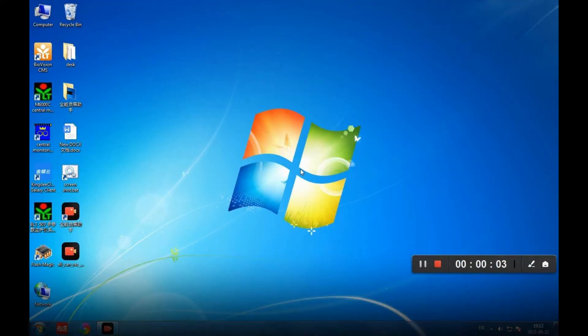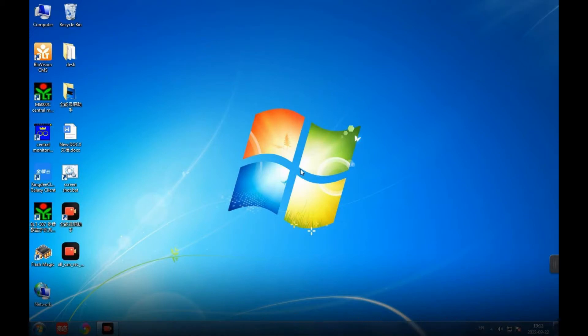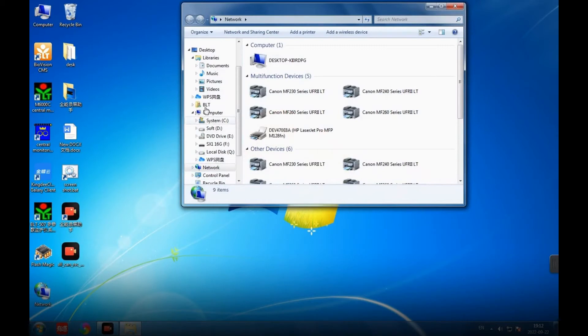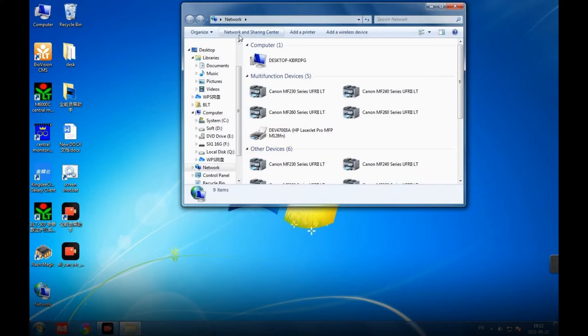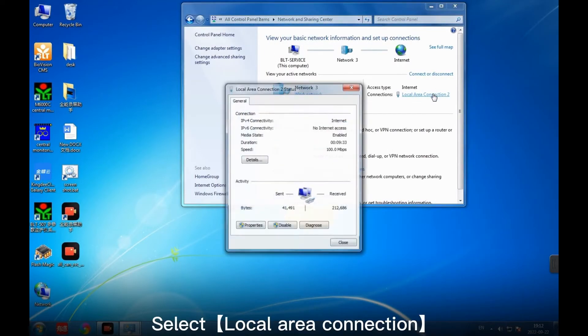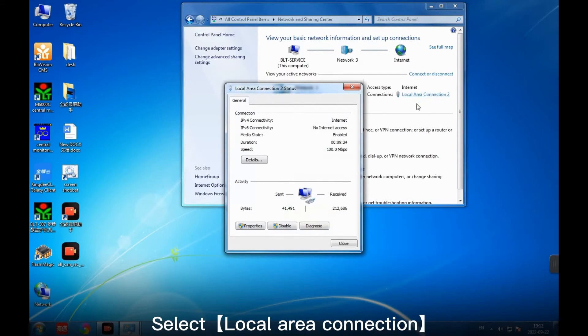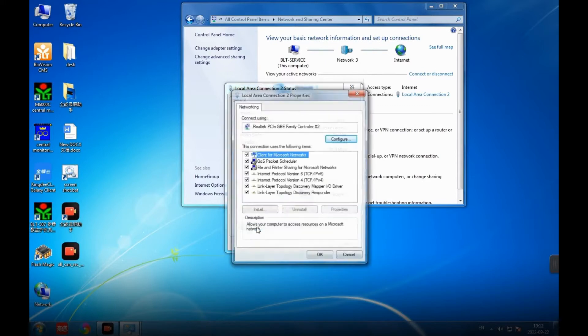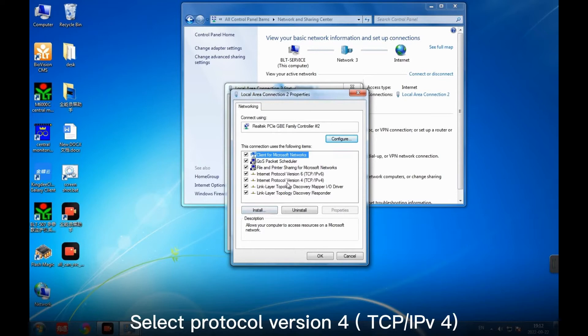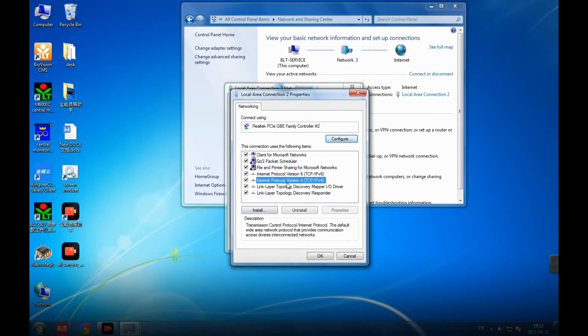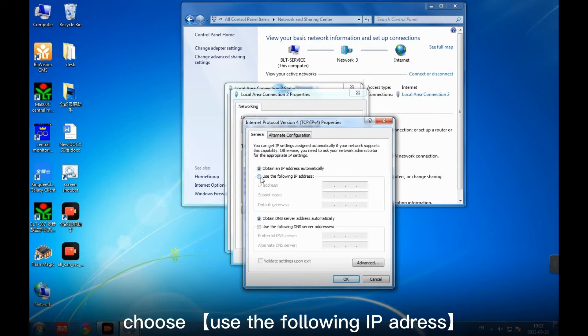Firstly, click Network button on the desktop. Select Network and Sharing Center. Select Local Area Connection. Select Properties. Select Protocol version for TCP IPv4.